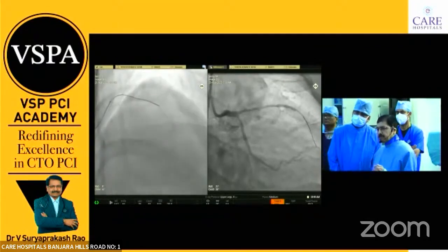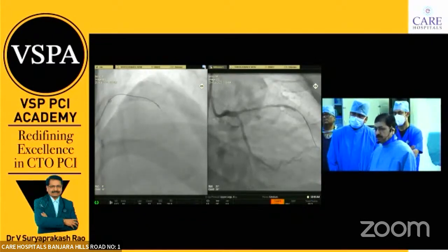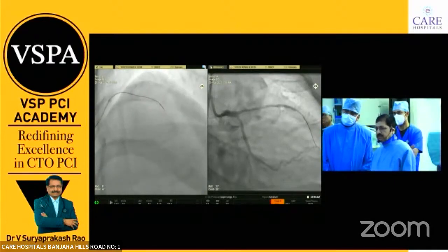Then we checked in 2 different views with the retrograde injections. Mostly I use the fluoro. Unfortunately, this machine gives extreme radiation in obesity, but I use fluoro save systems.